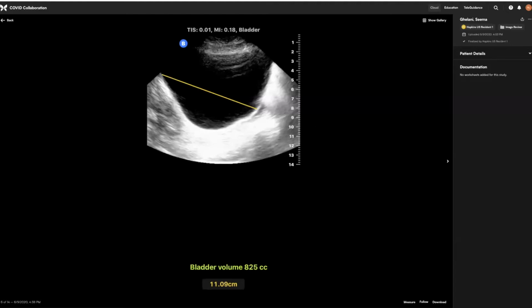Yeah, I mean, I've seen it done from the left side of the screen here, the directional indicator, the head side, from the upper segment closer to the near field, and then down across diagonally, almost like this. Although the upper edge, the cephalad edge of the bladder is off the screen clearly because it's so full. And then I've seen it done directly, what would be cranial caudal, as you're describing, just a line that's parallel to the skin imaging plane.